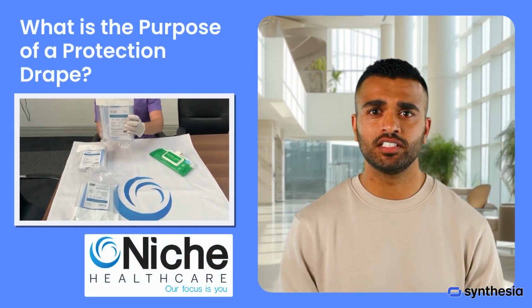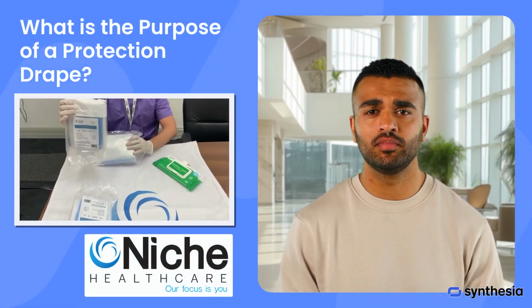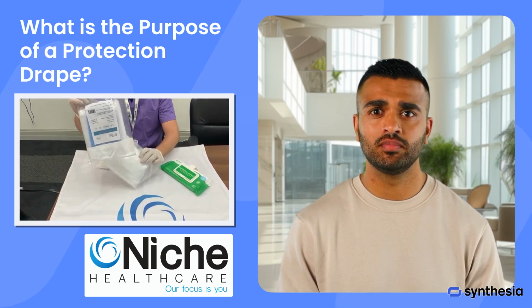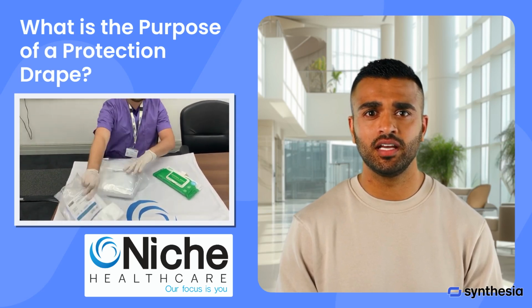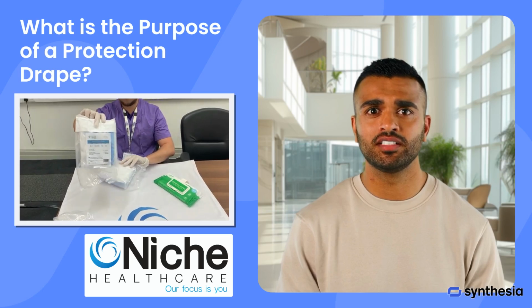A protection drape is a sterile barrier used in medical and surgical settings to maintain sterility and prevent infection. Its primary purposes are infection control: it maintains a sterile area, acts as a barrier against microorganisms and fluids, and minimizes infection risk. Patient safety: it reduces post-operative infections and controls bodily fluids.